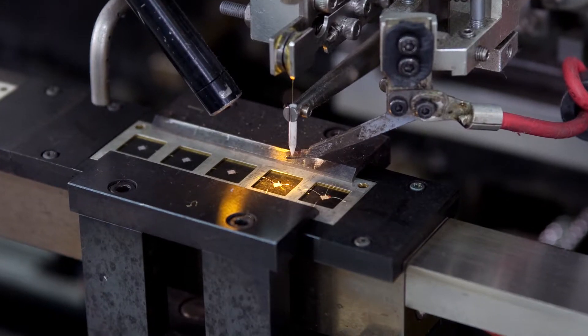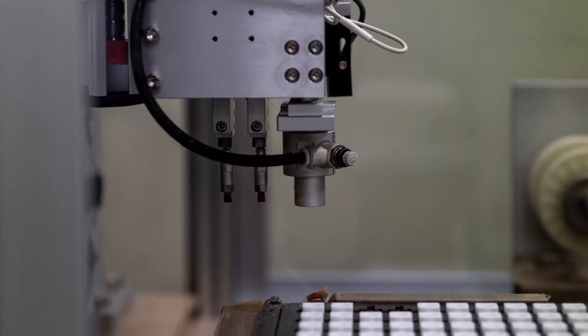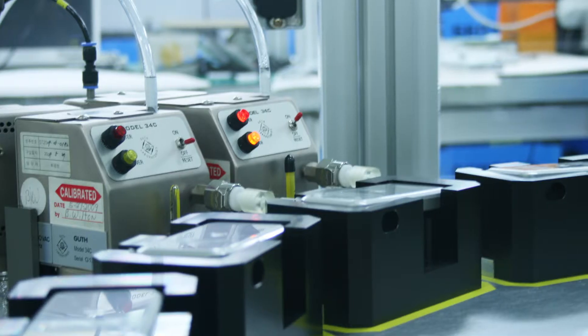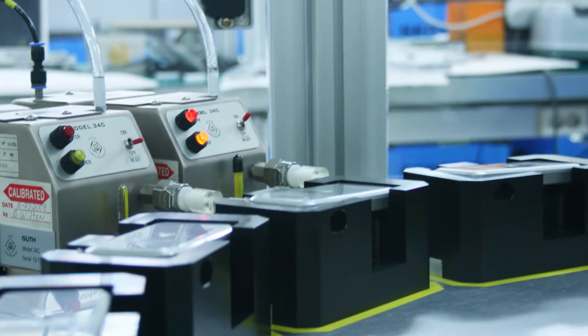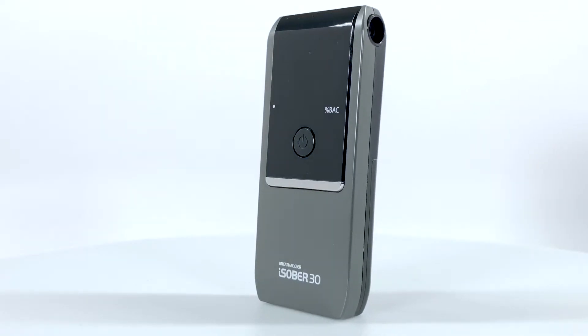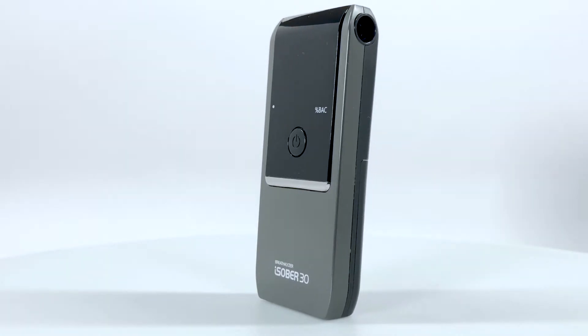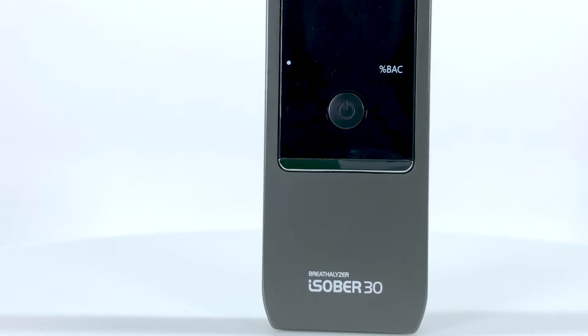It's important to note that all measuring tools are calibrated to ensure their ongoing accuracy. That's why the iSober 30 comes with its own calibration service, unlike cheaper manufacturers who care more about their sales numbers than accuracy and reputation. To guarantee consistent results, the iSober 30 has its own calibration display reminder, based on usage, and recalls the last ten test results.